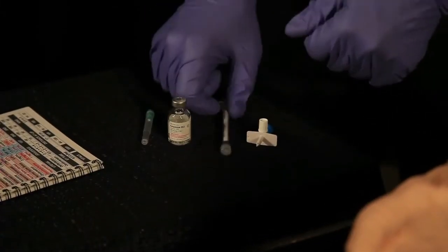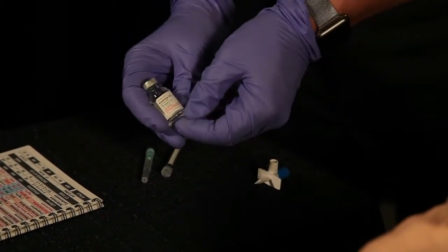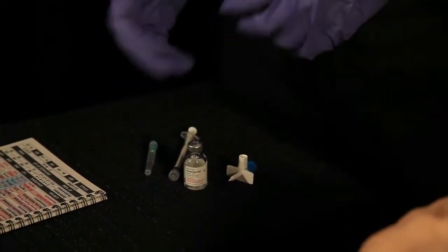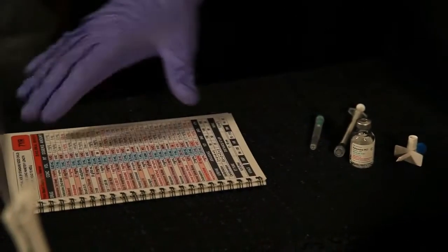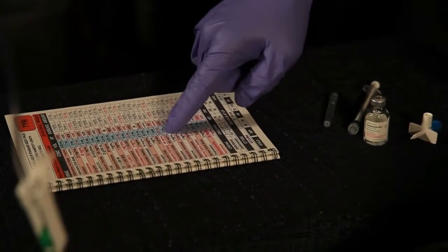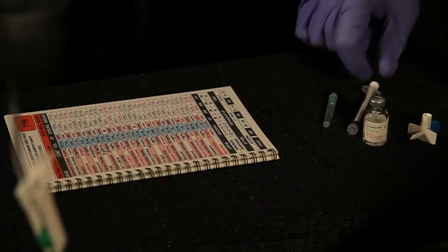So now we're going to demonstrate drawing up ketamine, same concentration as before, 100 milligrams in 1 mL, for advanced airway procedures in our pediatric patient. So for this demonstration, we're actually going to use a 7-year-old. We're going to utilize our Handtevy drug guide. We're going to look up under the 7-year-old page and find ketamine where it says RSI sedation. It's going to tell us our dose should be 25 milligrams, 0.25 mLs.